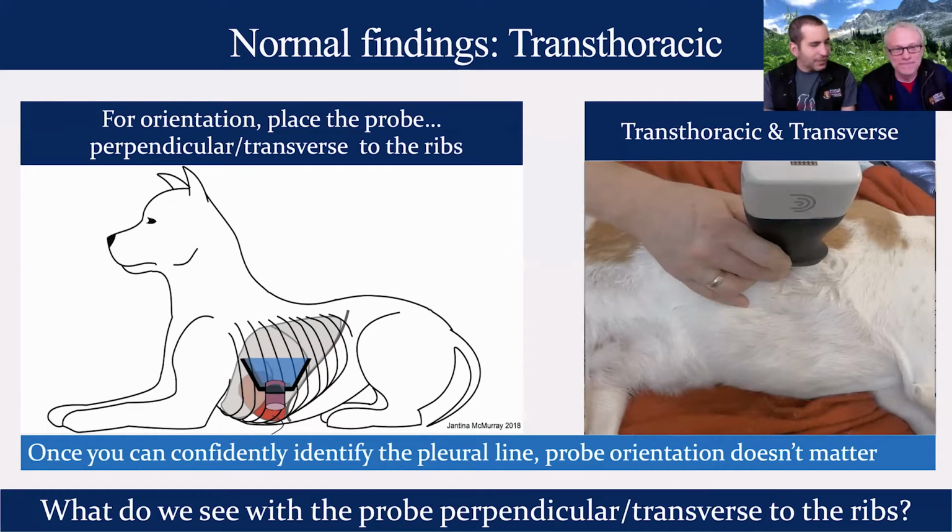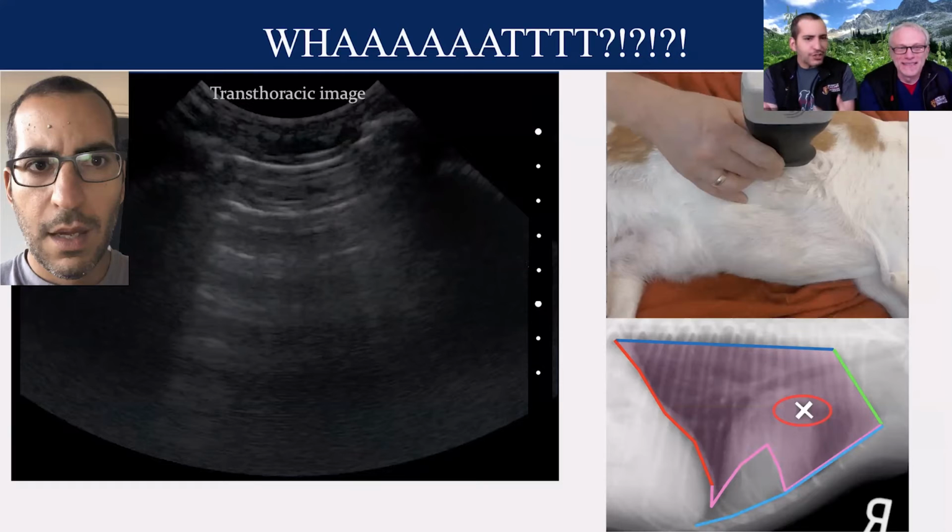What are we going to see? Well, that's what I was saying, Dr. Boysen. It's just so different. Your expression is going to be like, what? Where in the world are those beautiful soft tissue organs? All I see is a bunch of lines. I'm thinking I see a giraffe there, Dr. Boysen. Okay, that's quite the imagination. Even a radiologist would be impressed, Dr. Chalhoub. But we're looking at, exactly as you said, a lot of different lines and different shades of gray. We need to break that down because if we know the anatomy and the structure we're looking at, we can identify the underlying pathologies that we're concerned about.